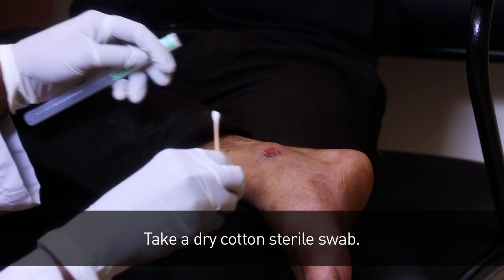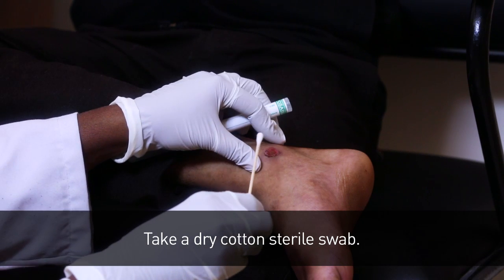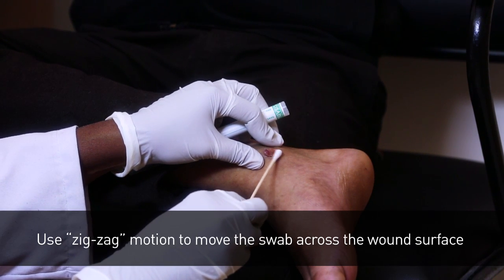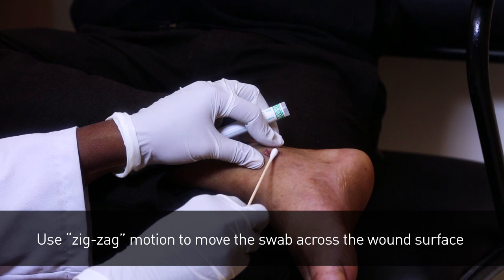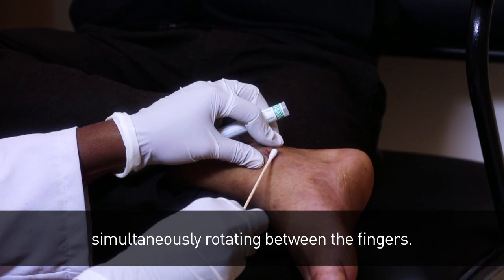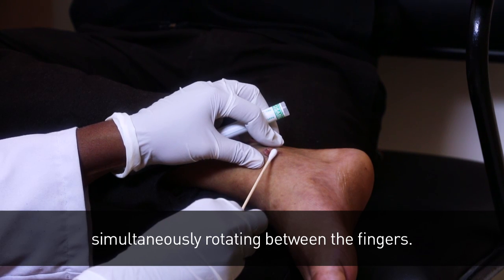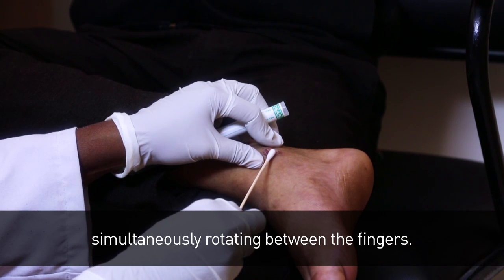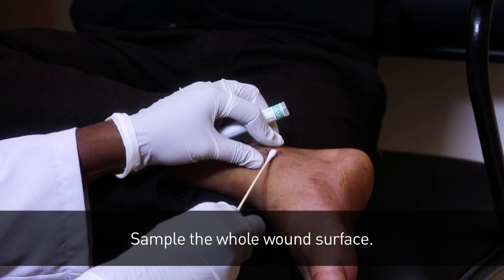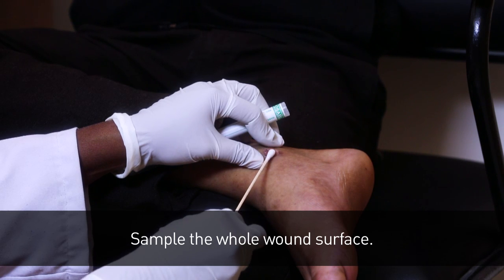Take a dry cotton sterile swab. Use a zigzag motion to move the swab across the wound surface, simultaneously rotating between the fingers. Sample the whole wound surface.